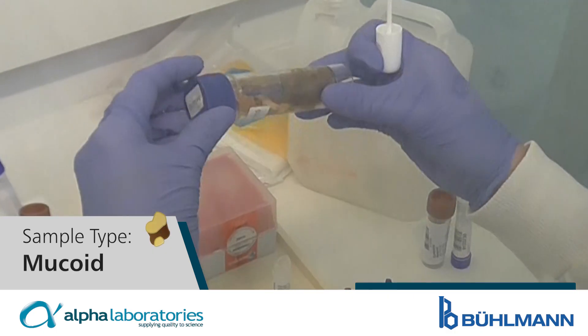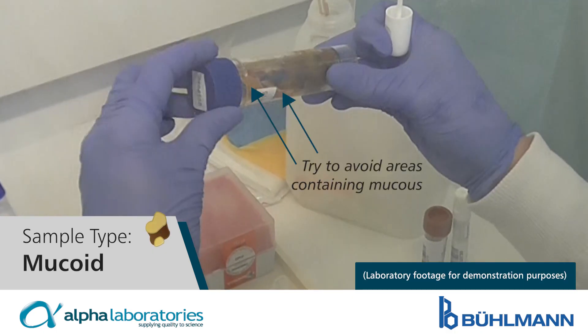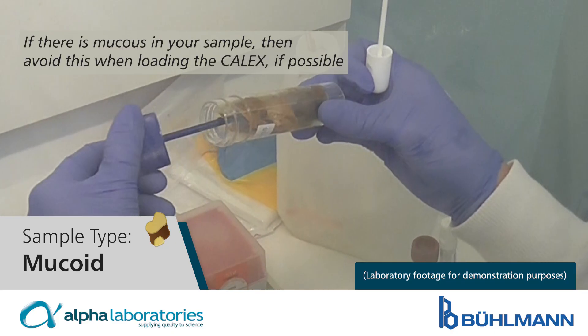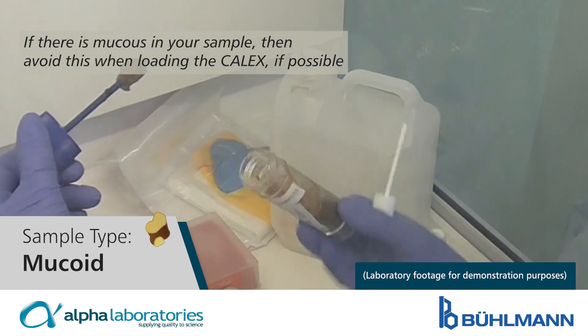Mucoid. Try to avoid areas containing mucus. If there is mucus in your sample, then avoid this when loading the CALEX if possible.